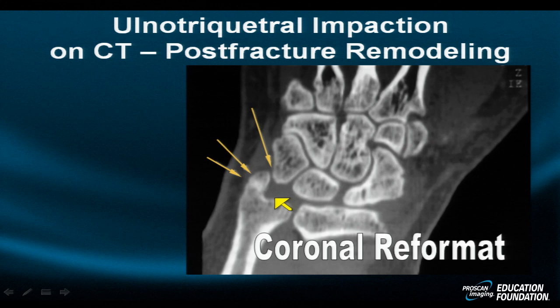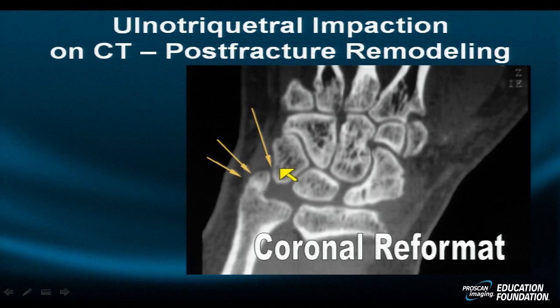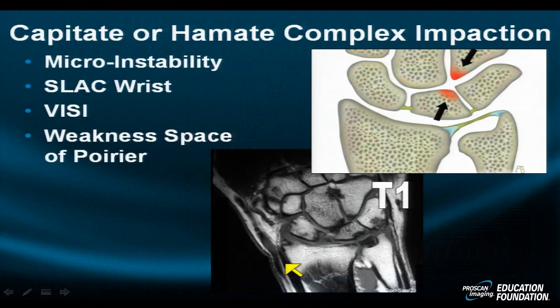Another example and cause of ulno-triquetral impaction is seen after trauma or fracture when healing is dysplastic or overgrown, as apparent on this 3D reconstructed coronal reformat sequence demonstrating even in the neutral position abutment of the ulnar styloid against the triquetrum. One can understand how this individual, a professional golfer, cannot ulnar deviate the wrist and therefore has lost significant yardage off of his ball.